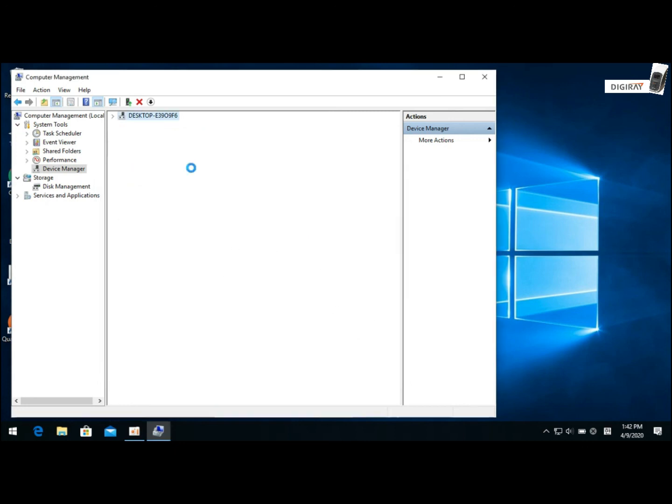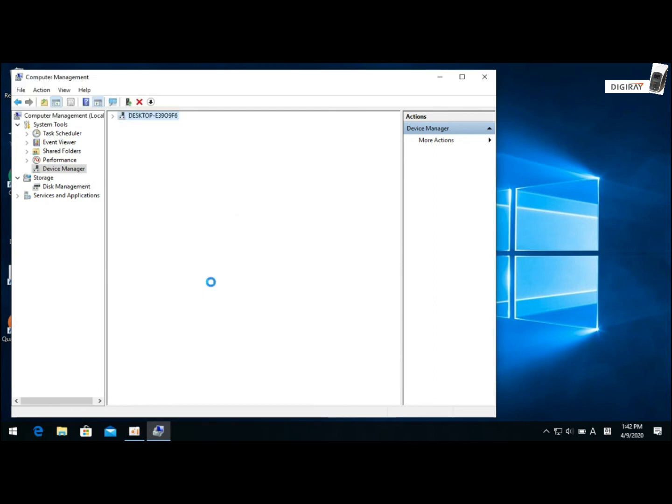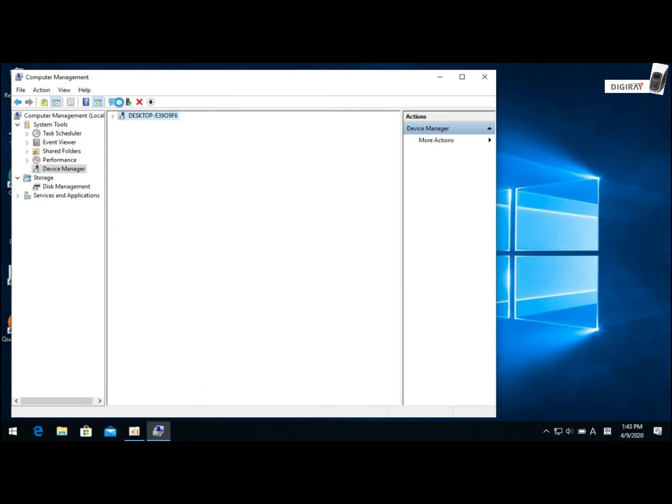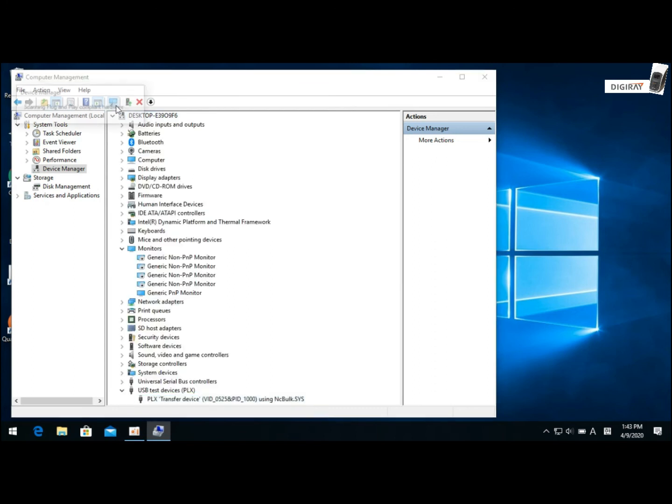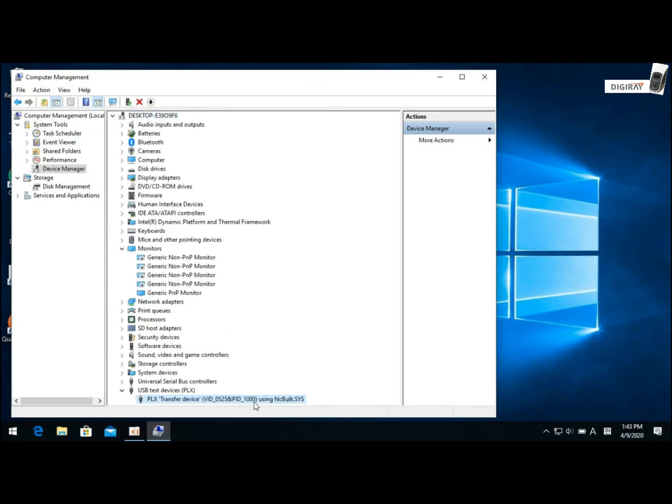Now, if you find this PLX, it means that the problem has been resolved. But if it doesn't appear, please click the search button up here that looks like a magnifying glass to make sure that PLX appears on the device manager.